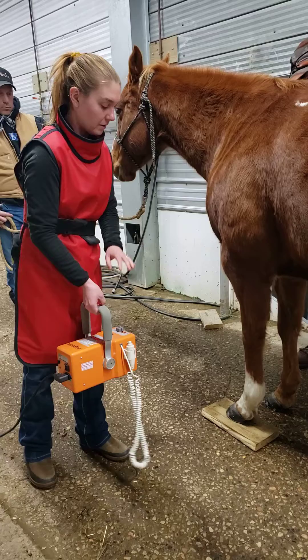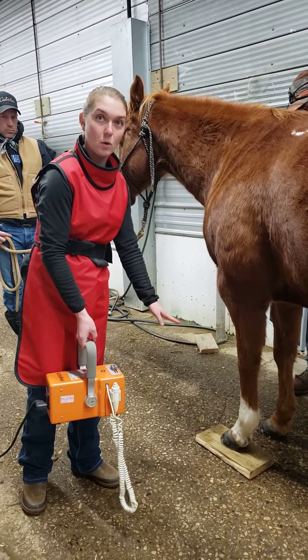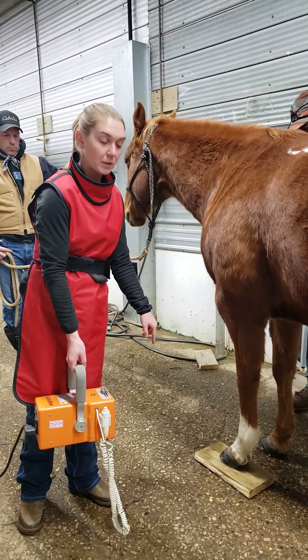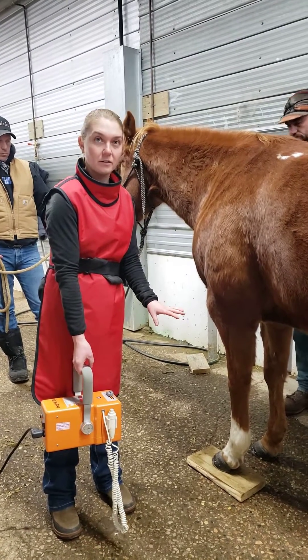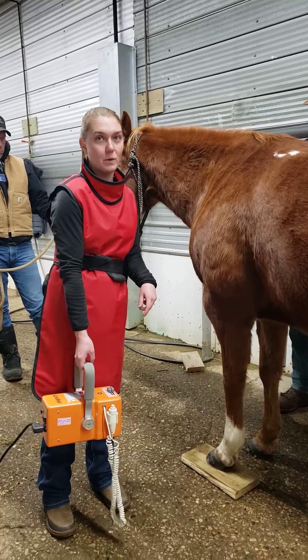You need your generator close enough to the ground so that you get the whole bottom of the coffin bone, which is why we have the horse up on a block. And then to get the proper bone alignment, how they are naturally, we lift up a leg so that the horse is in full weight bearing.